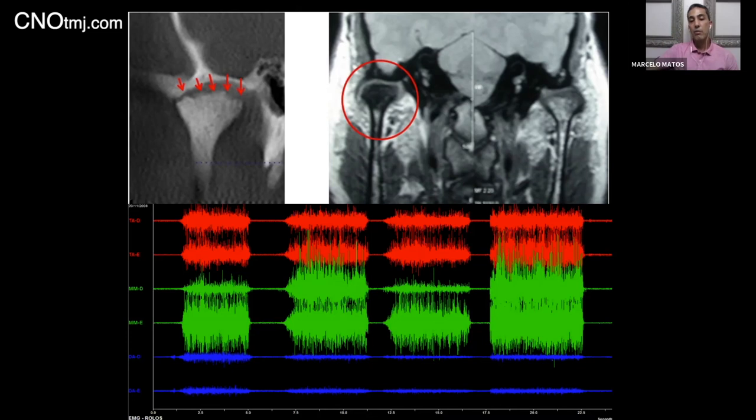And the muscles are not supposed to fire that way. In order to not create any more damage in the central nervous system, it just turns down that muscle. And actually just seconds later, with the cotton roll on both sides, boom, firing again.